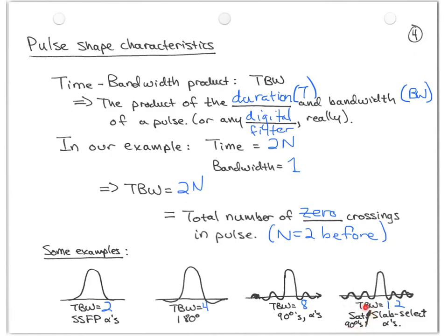Because when you perform a 90 degree excitation, the MZ component is 0 afterwards. Then if we play out a lot of gradients right after that, we kill off the signal from that excitation, and so that's called a saturation pulse, and we typically want sharp corners on those profiles. And the other thing we use them for is slab select alphas, right? Slab select pulses that excite something less than 90 degrees.